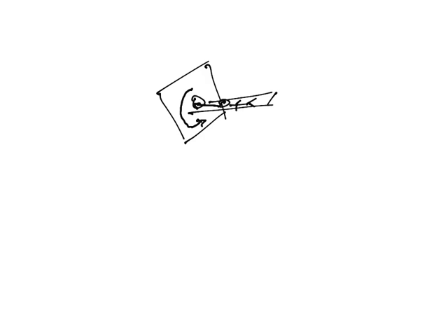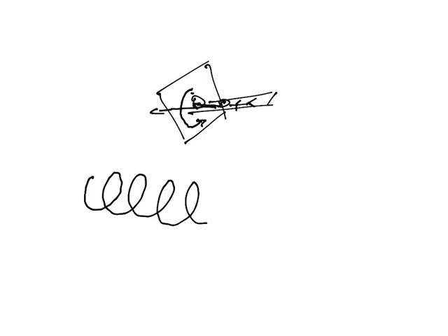Now it's kind of like a spiral sliced ham, where it basically makes this spiral shaped set of images. So as the person's sliding in, this is rotating around them at the same time, continuously. And so instead of a bunch of slices like this, you get this spiral shape instead. But it's all the same data.